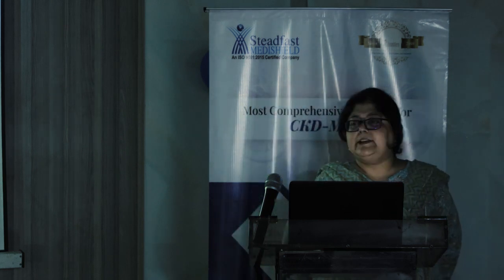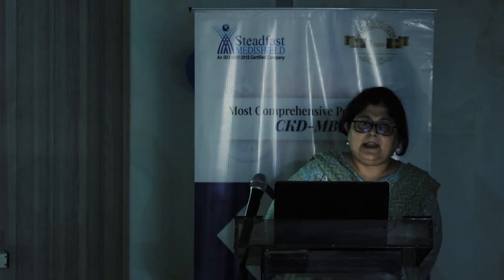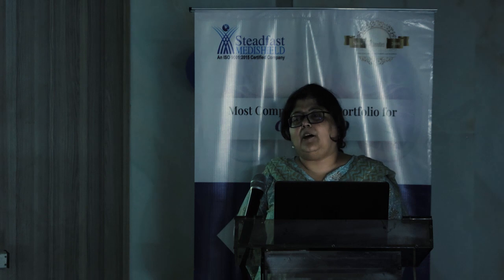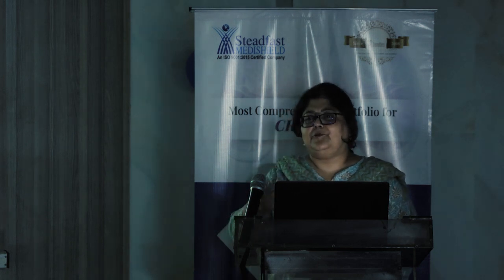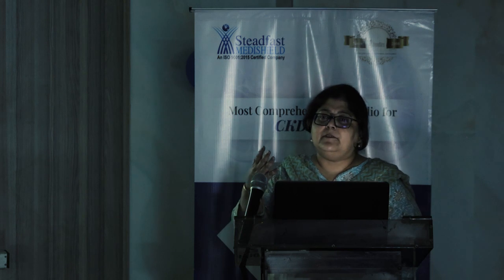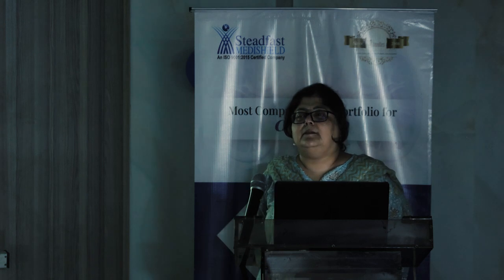I don't know which institutes you all are coming from. I worked for most of my life in Gangaram, and there, in their DNB final, they would at least get one renal scan which they had to read. So it's important that you know how to look at a renal scan. You know which is the right, which is the left. You know what is DTPA, how it is functioning, and what the different protocols of furosemide are. They will ask you, and it's something which is very commonly used in practice.